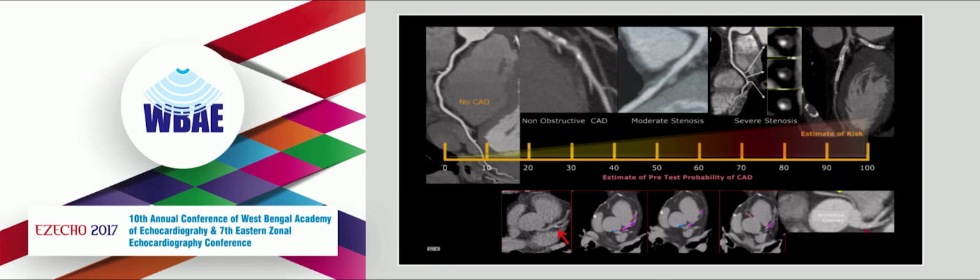You can also look at plaque morphology. You can see here a moderate stenosis, which in the olden days we would say nothing needs to be done, it's not high risk, is now proven wrong by coronary artery CT, where you can see high risk plaque, low attenuation plaque, which often corresponds to necrotic core, positive remodeling. All of this confer significant degrees of risk.